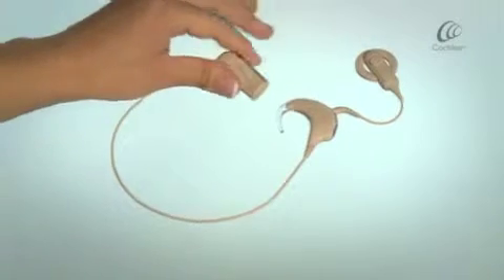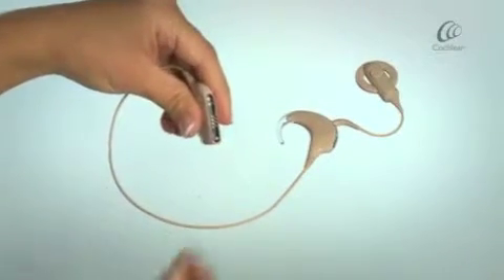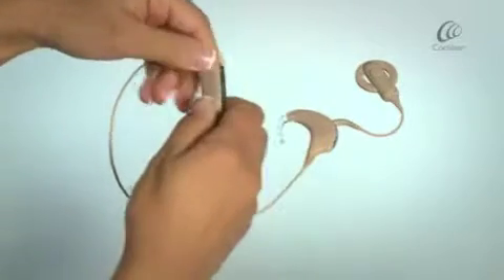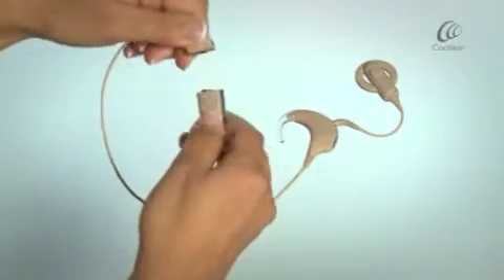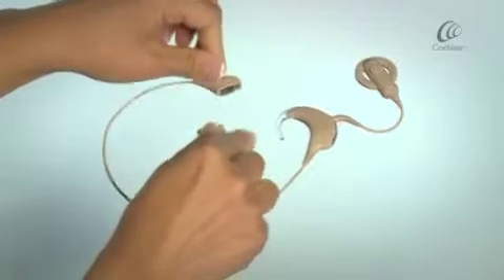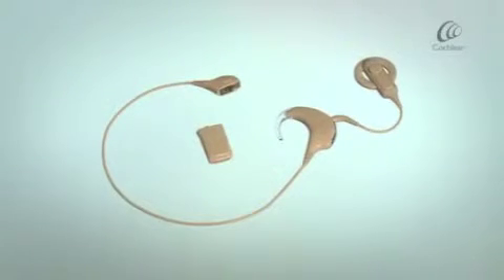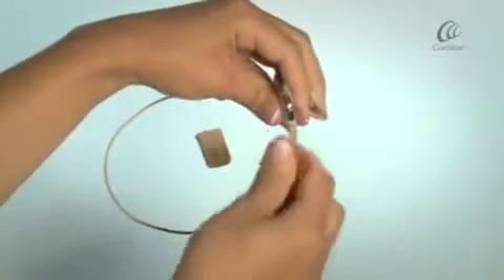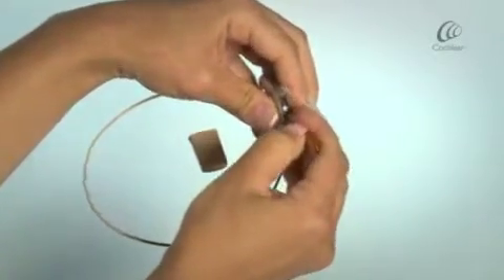To detach the Lightwear cable, move the lock on the battery module to the far right position. Twist the battery module and the Lightwear cable to separate. Lift the accessory cover on your processor and move the lock from the left to the far right position.